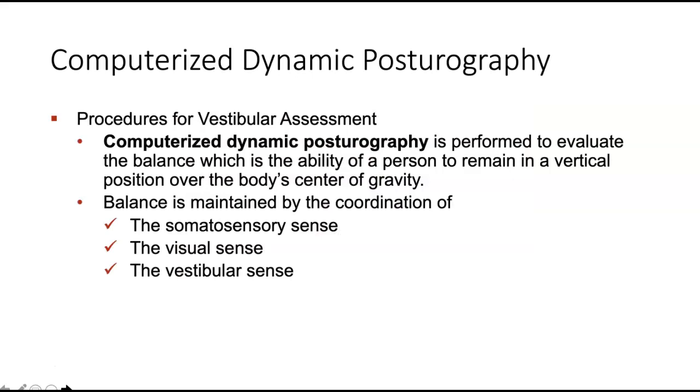Computerized dynamic posturography. The three senses that are strongly involved in balance begin with somatosensory. Here's an example of what I mean. If you took your shoes and socks off and stepped from carpet to hardwood floor to gravel, let's say you stepped outside your house onto the porch, your feet will detect the environment for you. That's your somatosensory input, okay? And then the visual we talked about, and the vestibular.